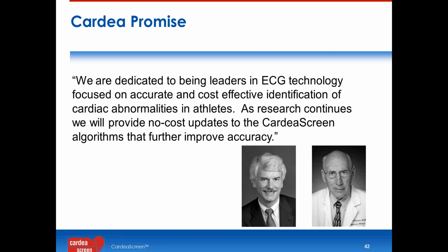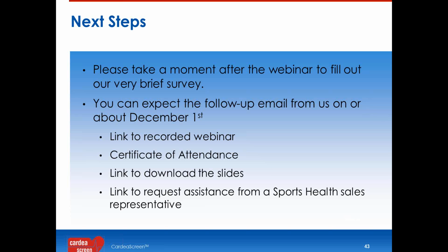Dave, you had mentioned that you can screen about 500 athletes in 6 hours if you set up the day before. Is that pretty accurate for large screenings? I think you can do substantially more. It depends upon how many stations you set up. For the foundation here in town, we set up 12 stations, 6 on the boys and 6 on the girls, staffed largely with volunteers. We do have on-site doctors that come in and provide an overreading consultation service. With that setup, we can routinely screen 400 to 500 athletes.